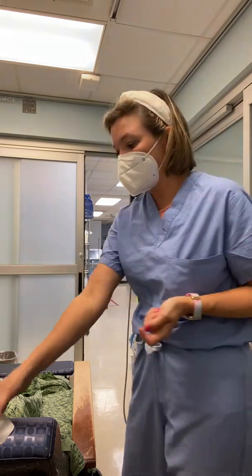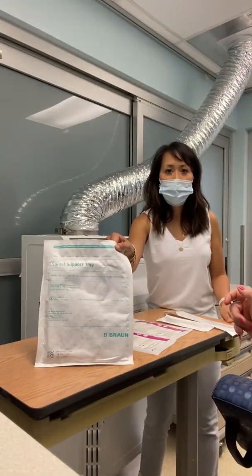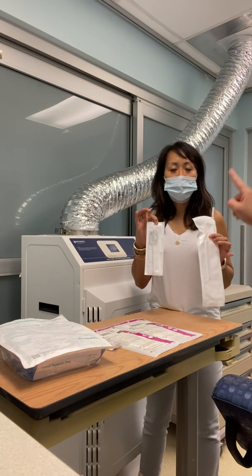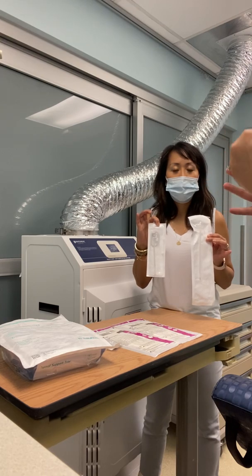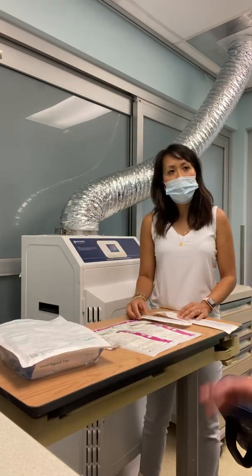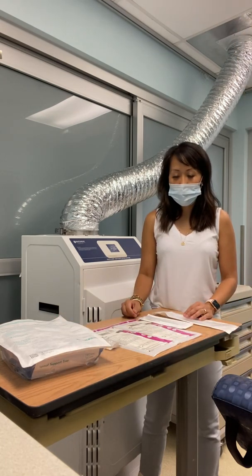The other supplies that will be gathered by the nurse are those that we'll put on our procedure table. These include the catheter kit that's specific for the infusion, the sterile gloves that the provider will be using for the procedure, the catheter needle, and the catheter kit. There are several different ways to gather the material. You can either have the catheters here, there's actually a replacement kit, there's a couple different ways to do it.